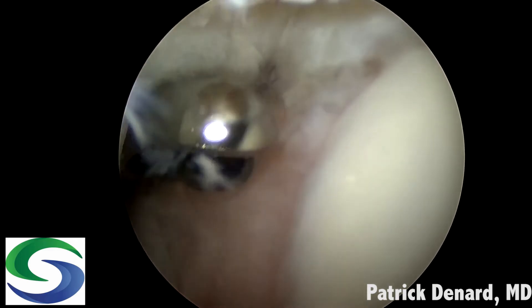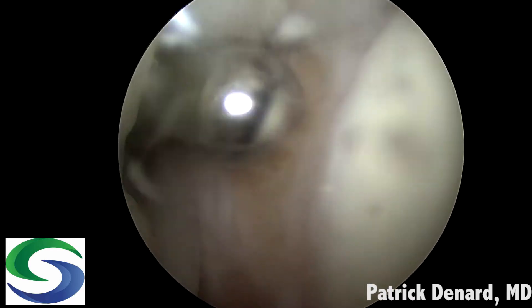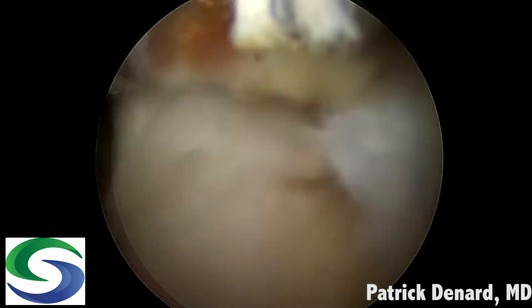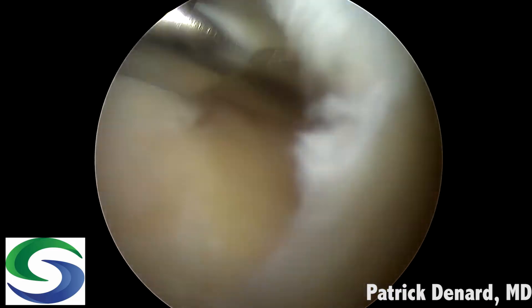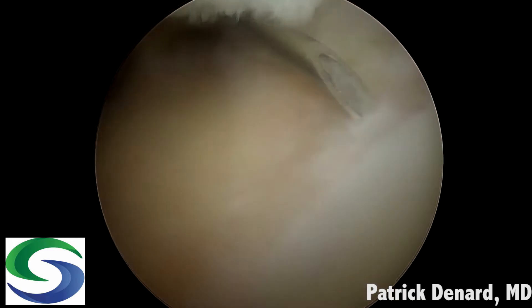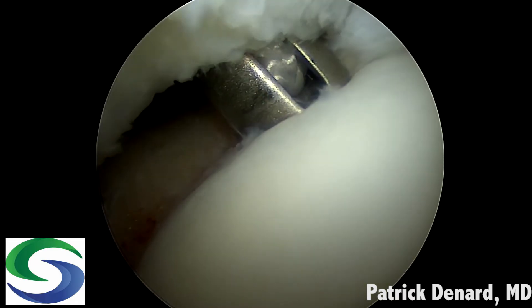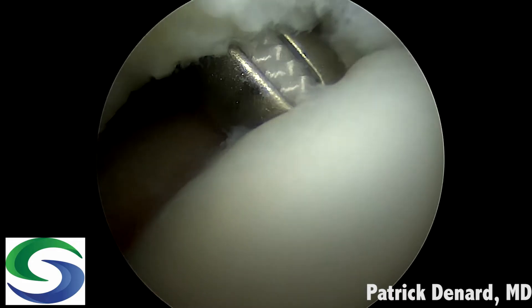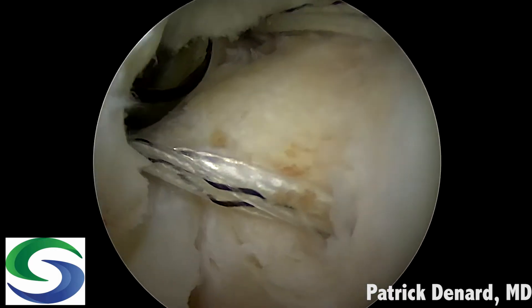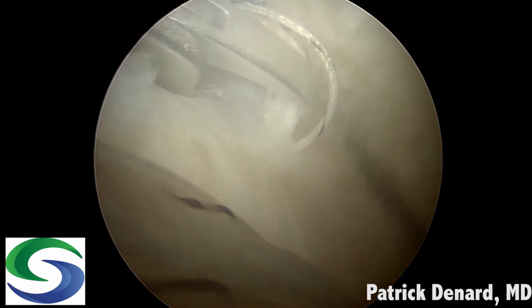Final case example: a left shoulder in a gentleman in his 40s. Here is the exposed footprint again with minimal retraction; the biceps tendon is also intact. Inspecting the subacromial space, there is very minimal retraction of this full thickness tear. Because the entire footprint is exposed I want complete footprint coverage, so I use the spinal needle as a guide and place a 2.6 mm knotless fiber tack anchor anteriorly with a punch. The posterior anchor is then placed. You can see how small that footprint is — with a larger anchor it would be difficult to place two threaded anchors.